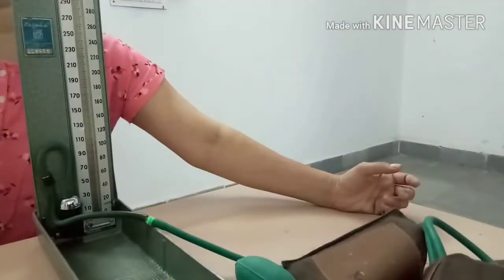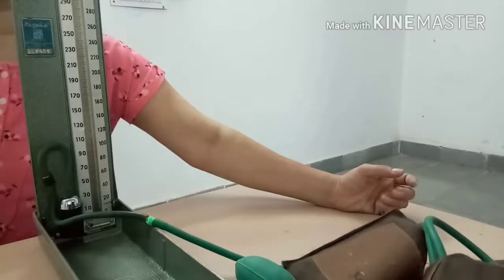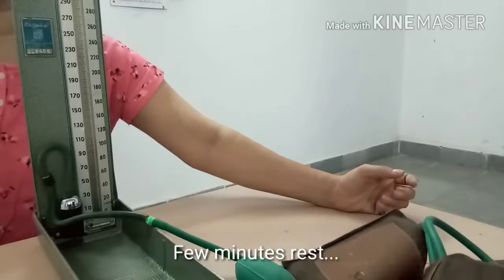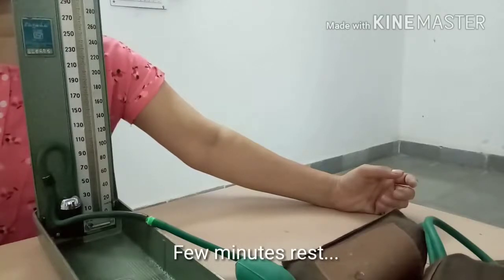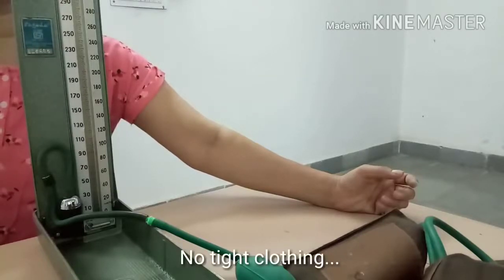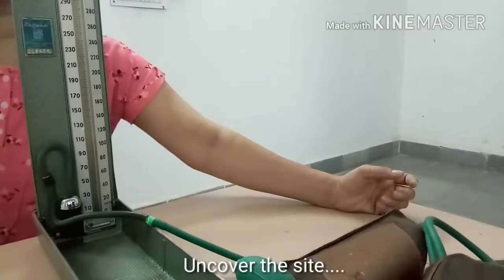During blood pressure measurement, the following precautions are required. The subject should be given at least a few minutes rest. No tight clothing is advisable. The arm of the subject should be completely exposed and kept at heart level.